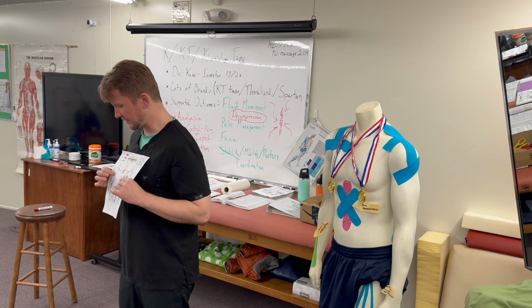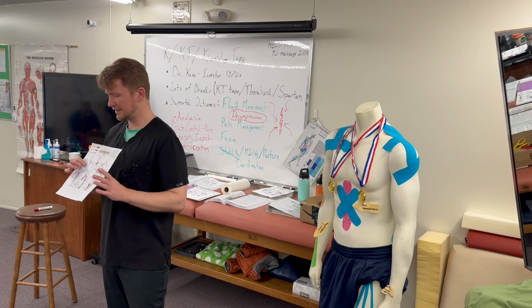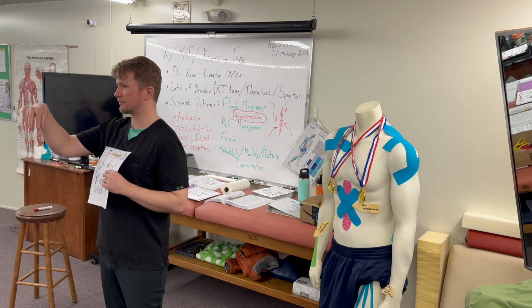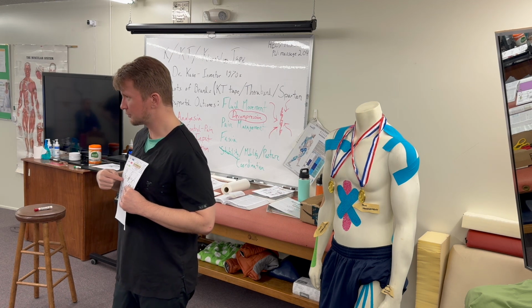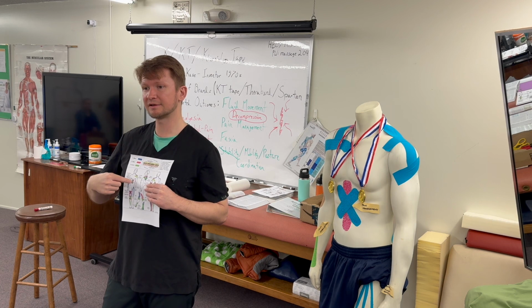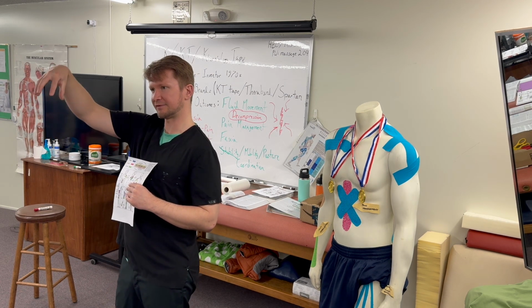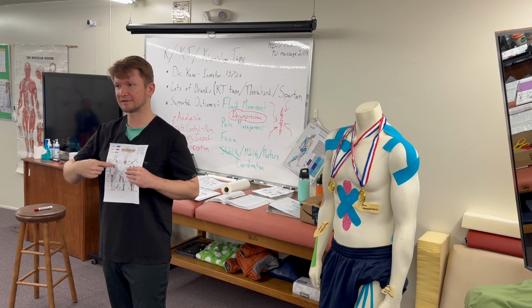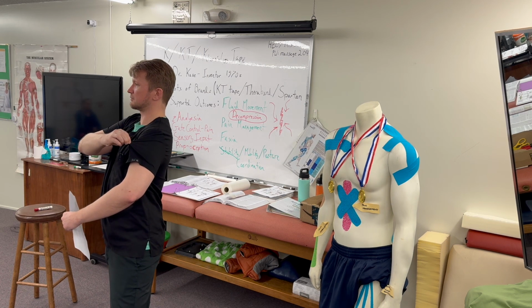Here, the idea with anything, it's just if somebody had a hot spot, it's just an angry place. If we put lots of tape over top of that spot, we're maybe getting more and more of a lift. So this is getting close with multiple layers overlapping on one spot, more like a cupping action. Really lifting and decompressing that spot right where the center of the star is. That center point is getting lifted up as much as possible.